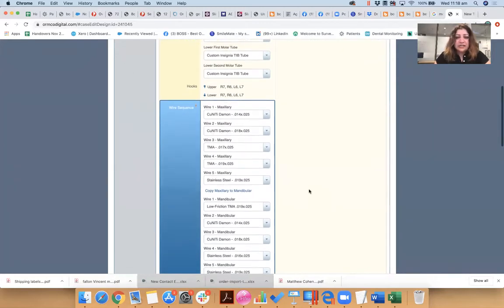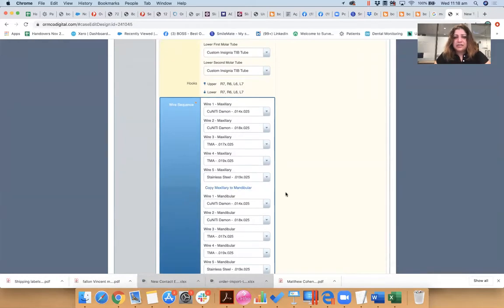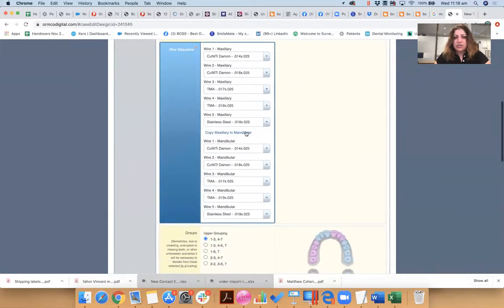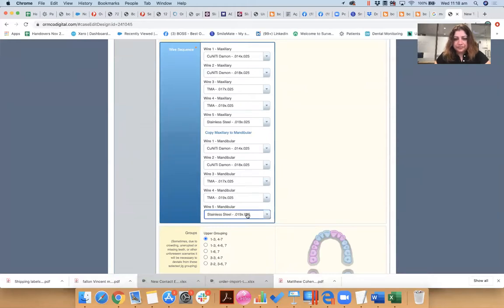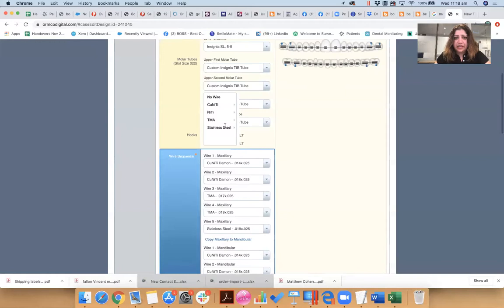Okay, or it may not, really depends what you want to achieve. But this case is a Class I case with a bit of crowding, so I'm going for this sequence. You can copy this entire sequence to the mandible as well, but when it comes to stainless steel and mandible, I do like to keep it a little bit low.